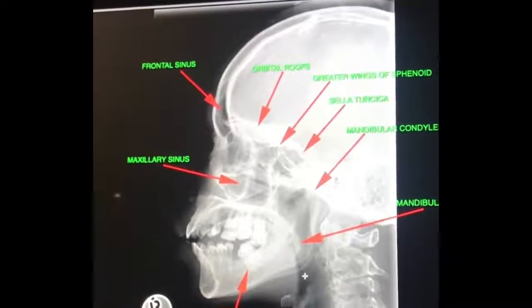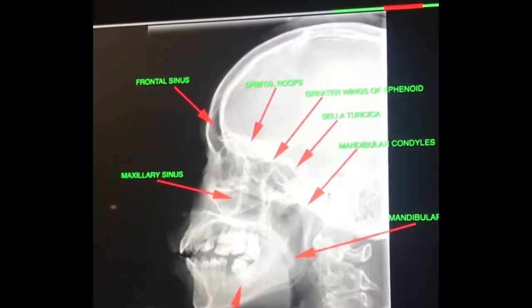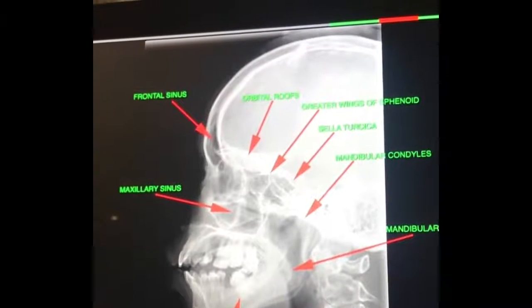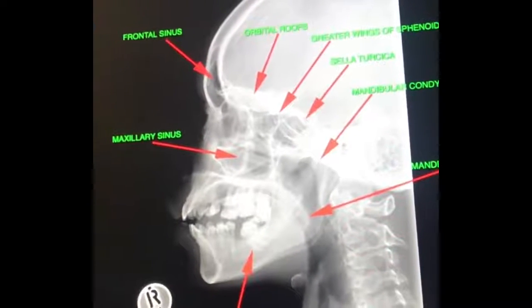So on this image you can see there is a slight rotation of the patient's mandibular rami, which could mean that there's a bit of rotation, and then your orbital roofs as well. You can see that your structures are not appearing nicely as a single area.